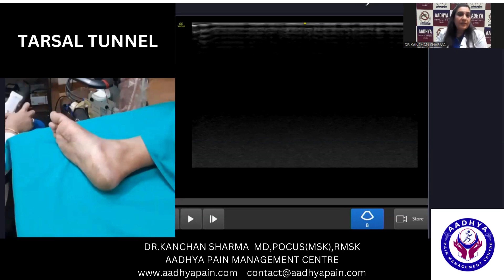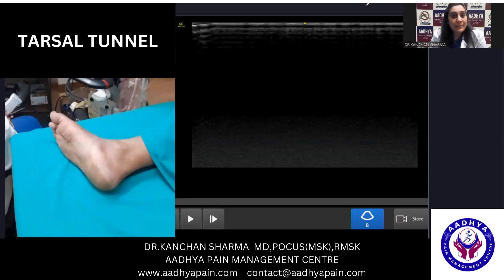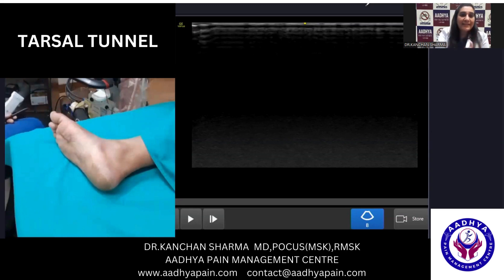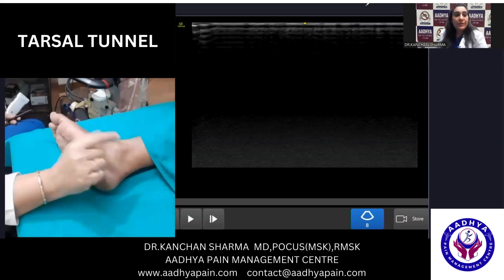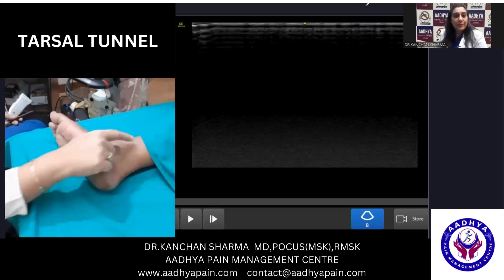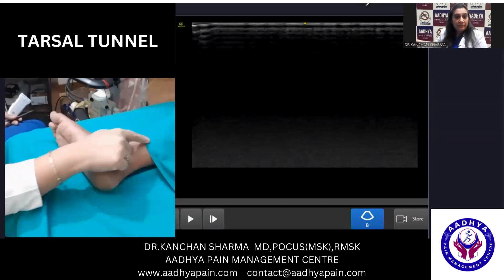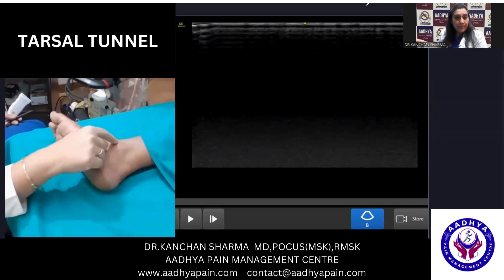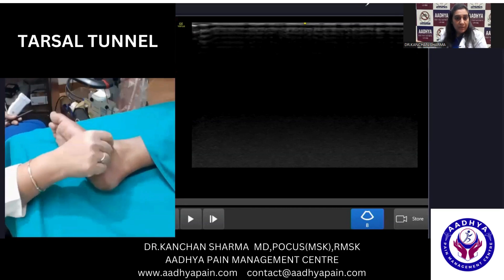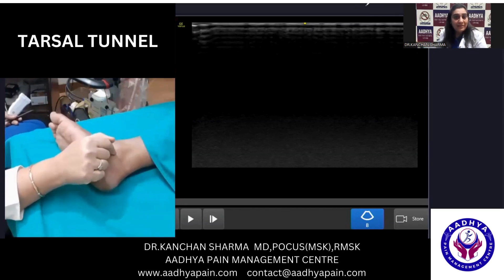I always say that you palpate the bony things, and that really helps you a lot in keeping your probe exactly in the position where you are looking for. So here, what you need to do is you need to palpate this bumpy thing which is here — this bumpy thing on the medial side is the medial malleolus.